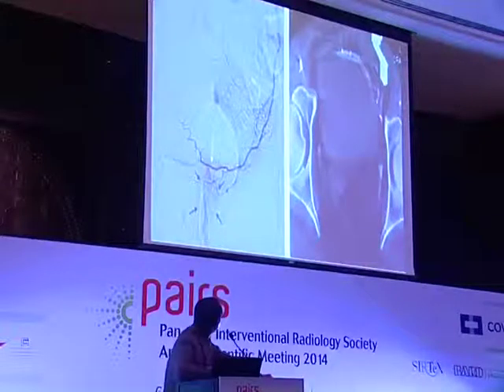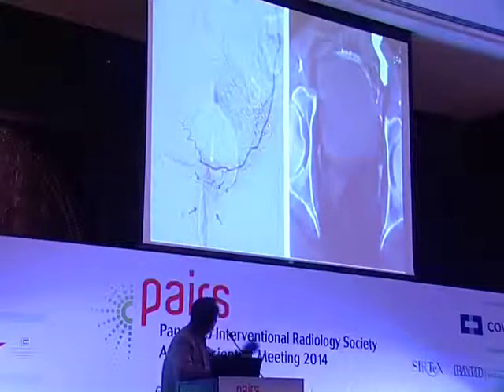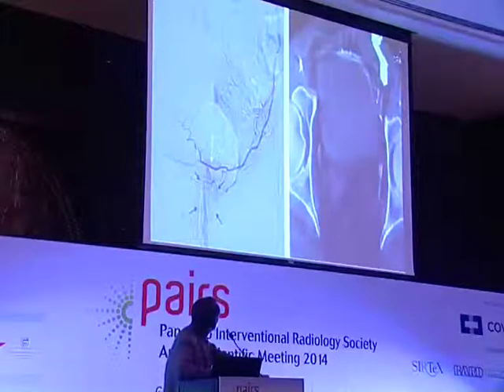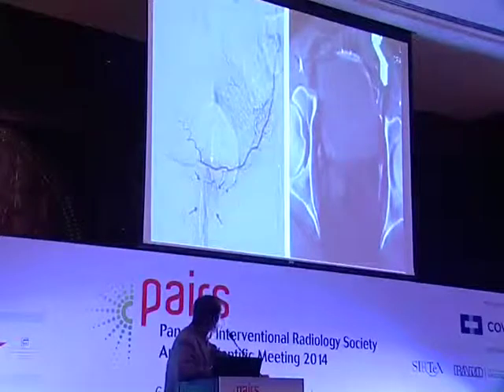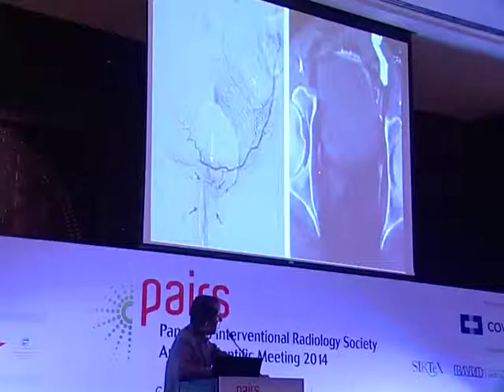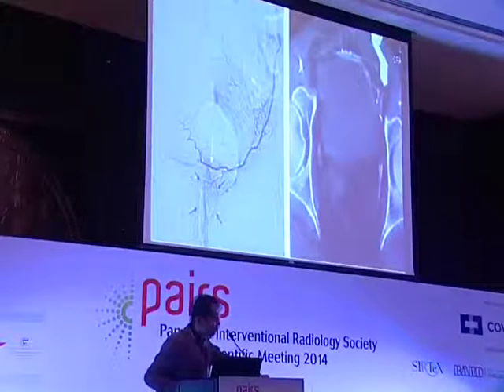Another difficult patient also, superselection on the contralateral side, injection of contrast. Probably it was thought that this is the prostate. CT angio shows that this is not the inferior vesical artery. As a matter of fact, this is the superior vesical artery with a capsular branch, and there is supply of the bladder wall. This is, again, a vessel that you have to avoid embolizing. Otherwise, the patient is going to have necrosis, probably focal necrosis.